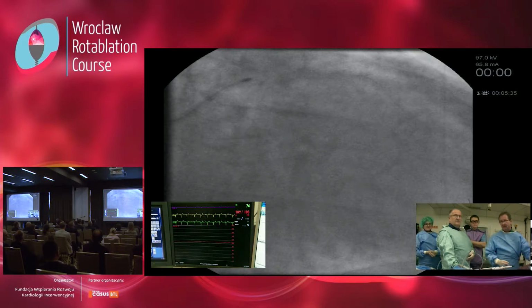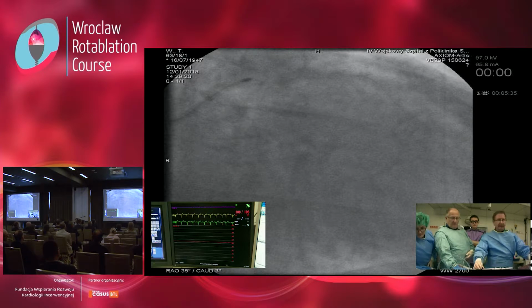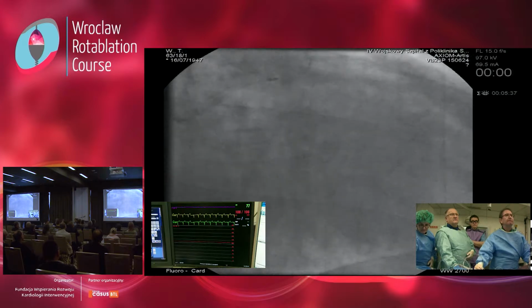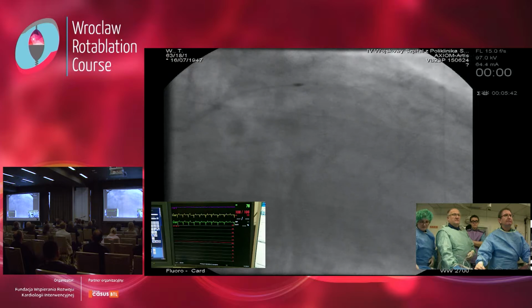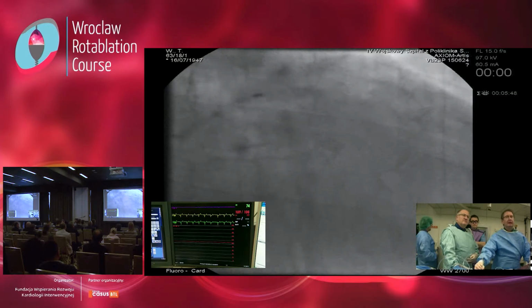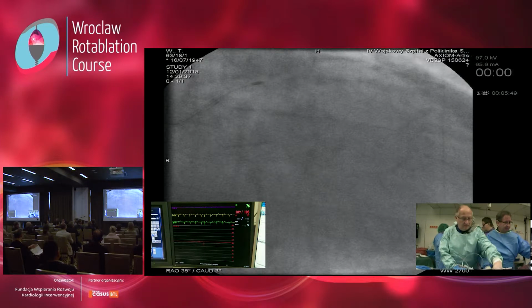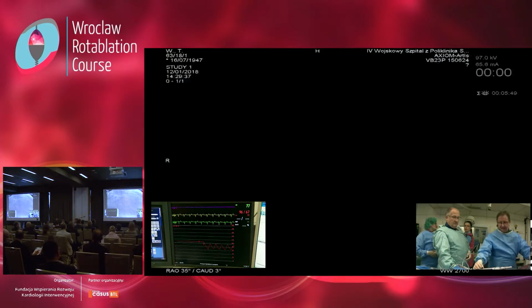Okay, it's hard lesion, so we go back after 8-10 seconds and go forward again. You heard what Dr. Gaul is always telling, the sound is changing, so then it's time to go back.